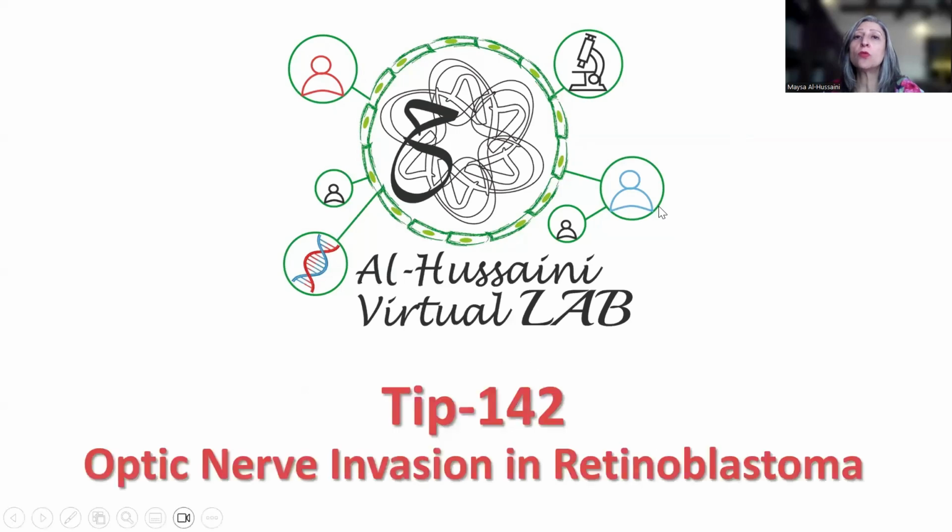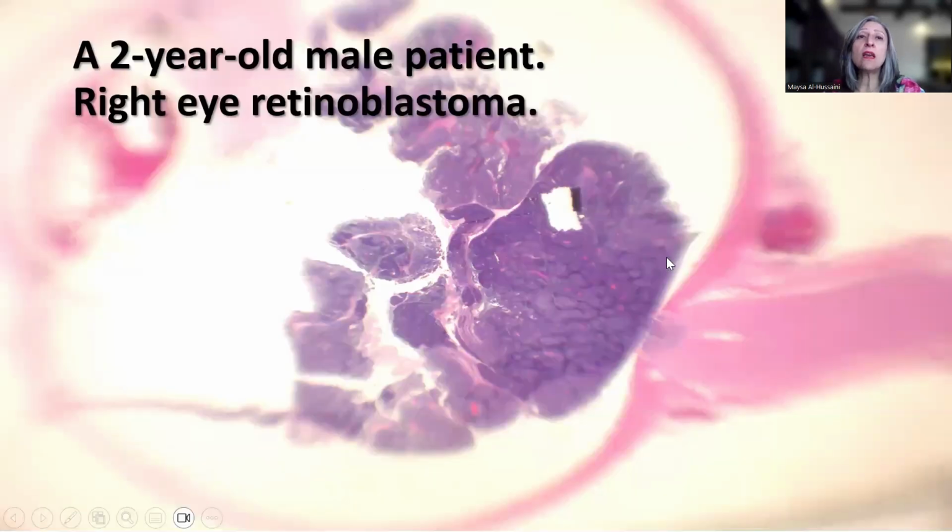What I'm going to be sharing with you today is a nice and typical example of optic nerve invasion in a case of retinoblastoma. This is a case of a 2-year-old male patient who was diagnosed with right eye retinoblastoma. And this is a low power, or actually scanning magnification, of the enucleated globe, the PO section, the pupillary-optic nerve section, which is the single most important section in order to render the proper diagnosis as well as to assess the high-risk features that are characteristic of retinoblastoma.